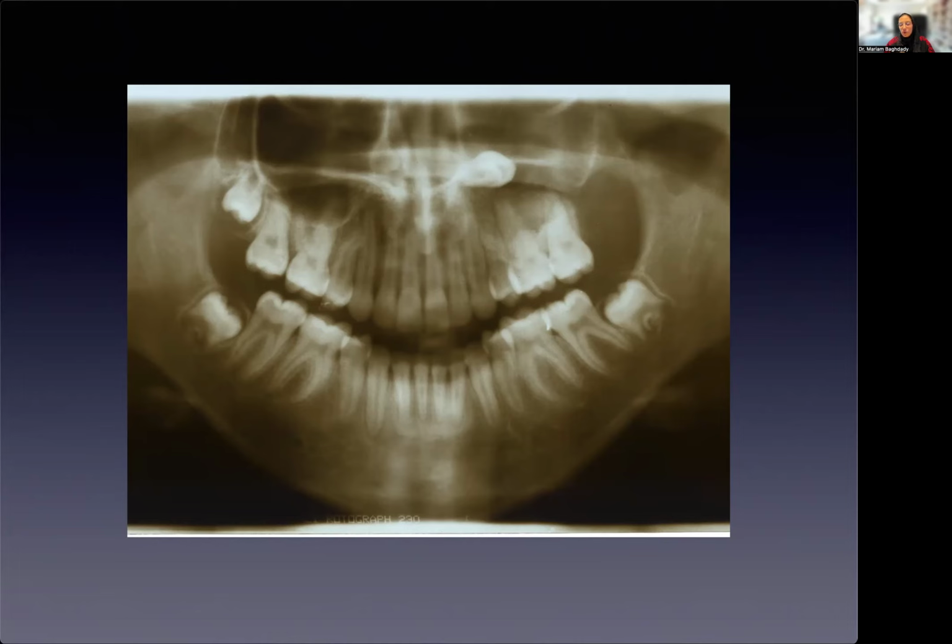And the only time something can be obstructed is if it can't be removed for any reason. A hearing aid, an implant, a non-removable hearing aid, of course, then that is something you can't do anything about. But if something is removable, always remove it. So I hope that nobody gets into that situation ever.